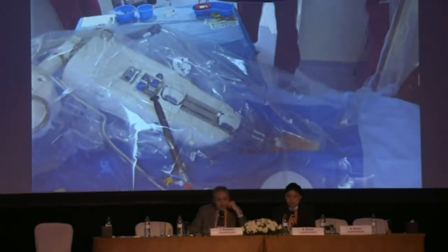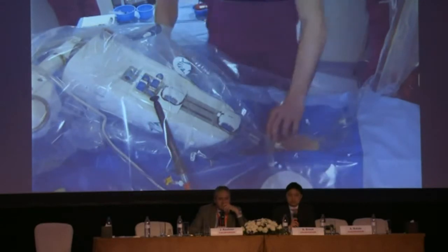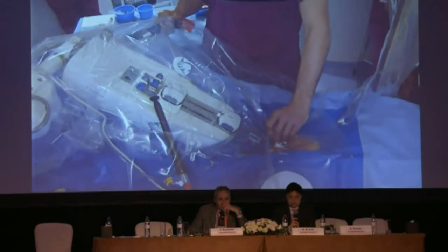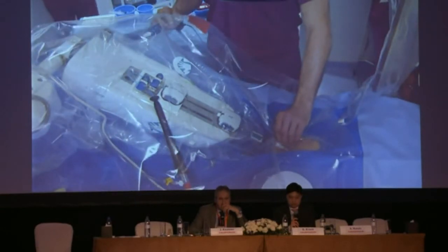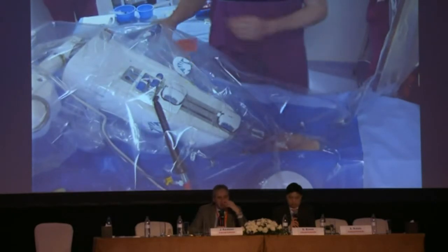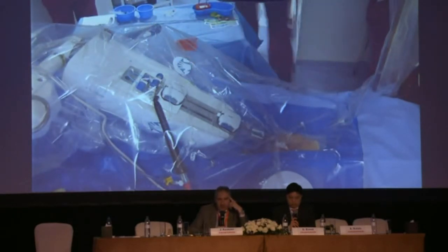Now that I've isolated all the veins, I'm going to just switch my PV catheter into the appendage, just to use that to then map the AF characteristics and get an idea of what's going on in the rest of the atrium now. So what will be your strategy for this case after isolation of pulmonary veins?